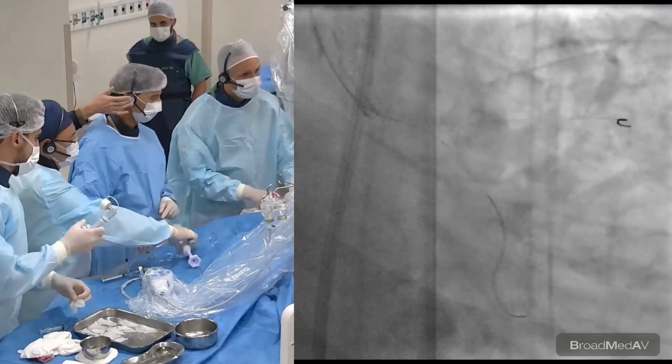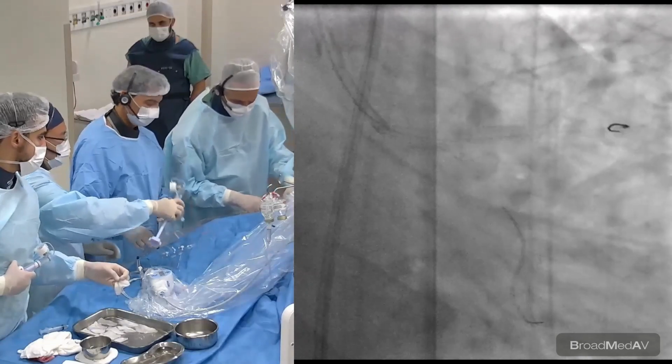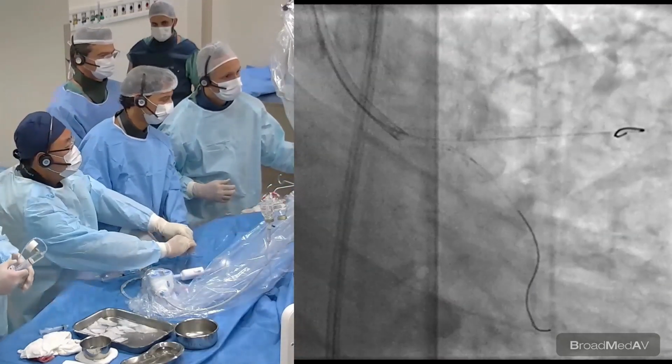So now you're going to do a control IVUS. Can we do a control angio here? Yep.